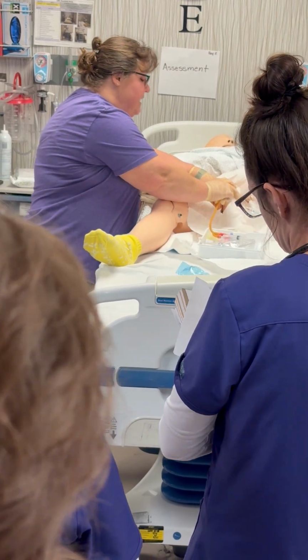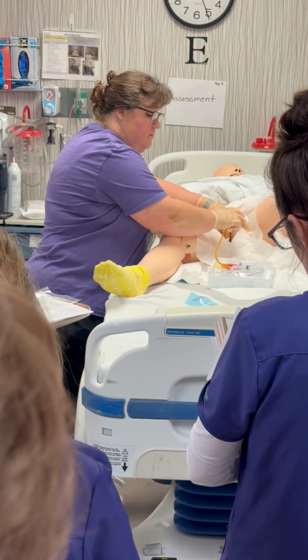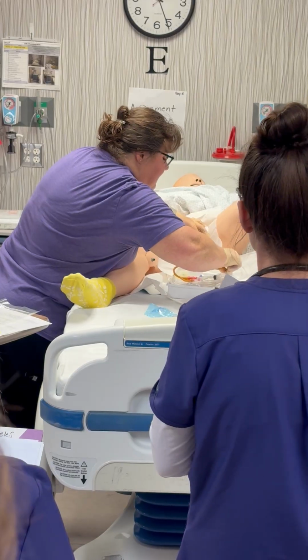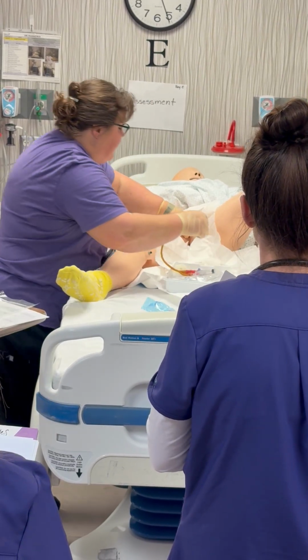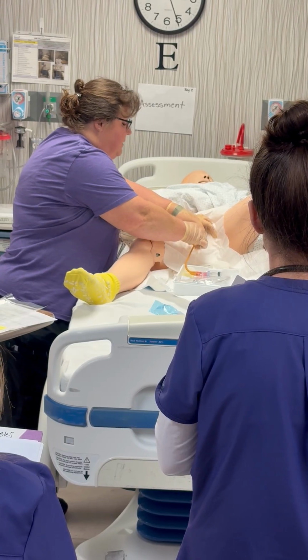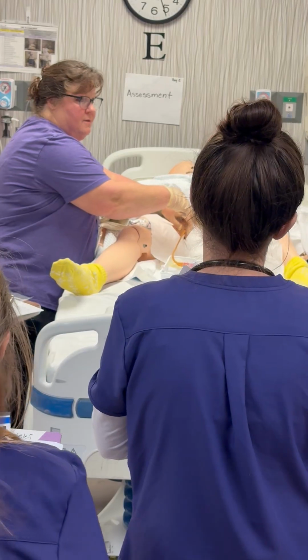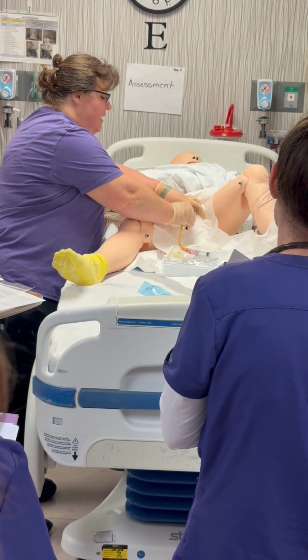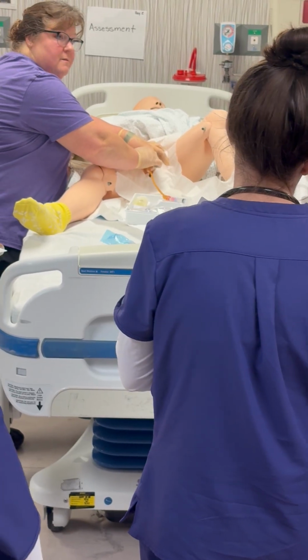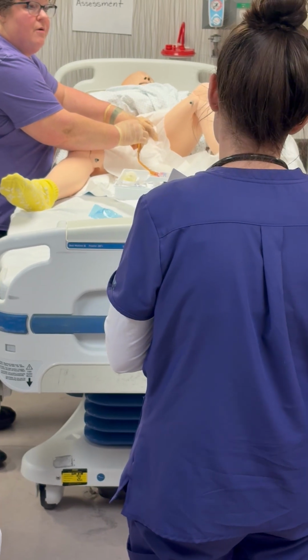And one of the things that gets people is that they start pushing this in. You would not do this, don't look at this part. Okay. All right, so you put this in, and what gets people is that they touch their hand, sterile, non-sterile. So make sure that you're walking your hand back and not touching that area when you put this in, okay? So now I got urine back, and then how far do I go?